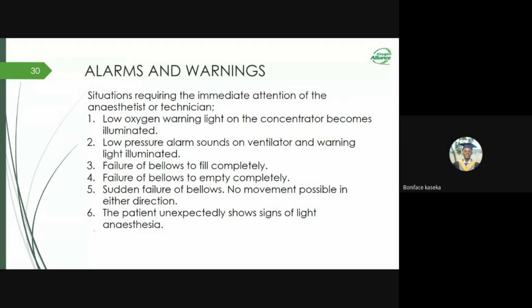Now, when we have an alarm or a warning whereby the bellows fail to fill completely, this is many times due to loss of drive gas pressure. And this can be solved by continued ventilation manually, just in order to make sure that we don't lose any life or cause any inconvenience. So we can just switch to ventilating manually until a further source of drive gas is available.